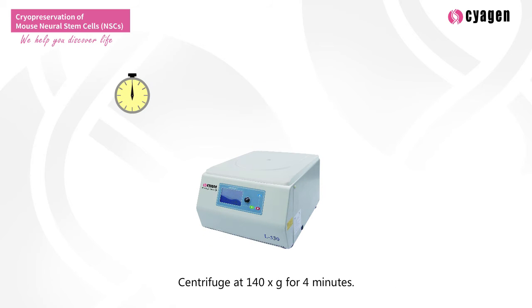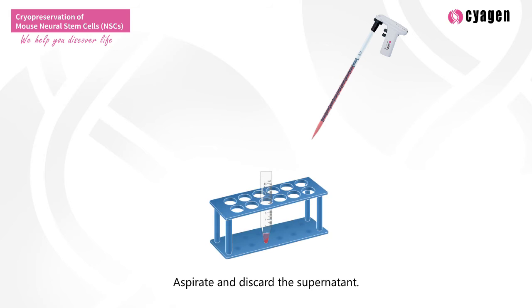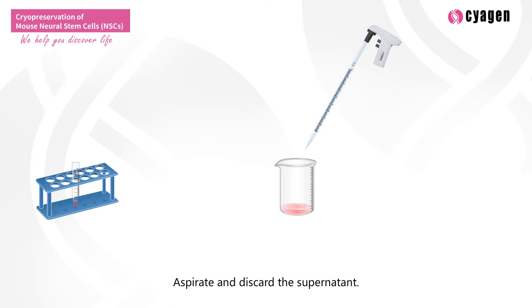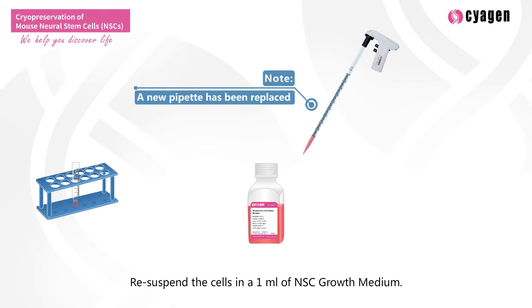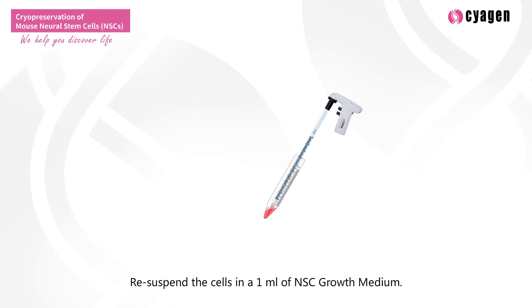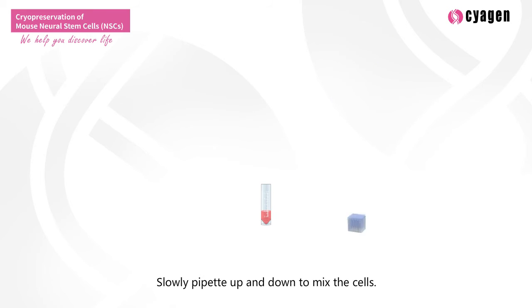Centrifuge at 140 times G for 4 minutes. Aspirate and discard the supernatant. Resuspend the cells in 1 ml of NSC growth medium. Transfer the cell suspension to a 5 ml EP tube.